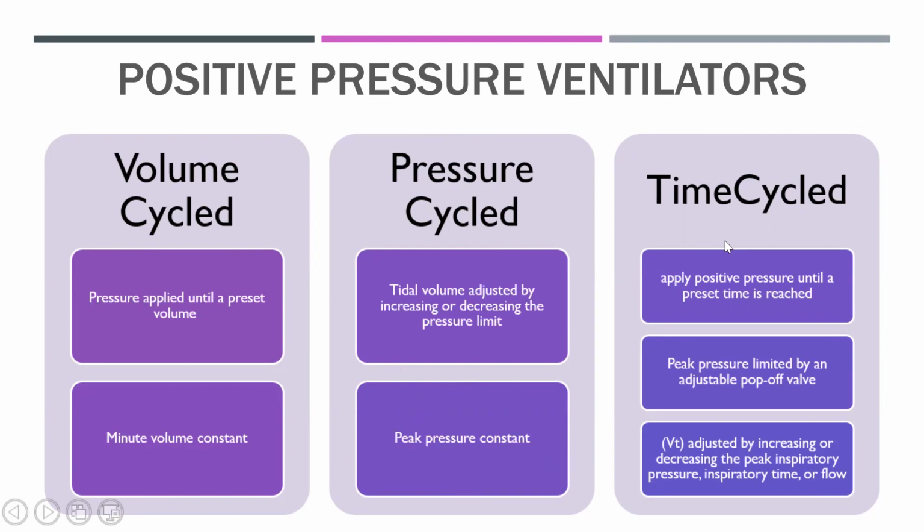Time cycle. As it says, time, that means I will set a time, let's say 1 second, and the pressure and the tidal volume will be delivered in this 1 second. It will cut off.